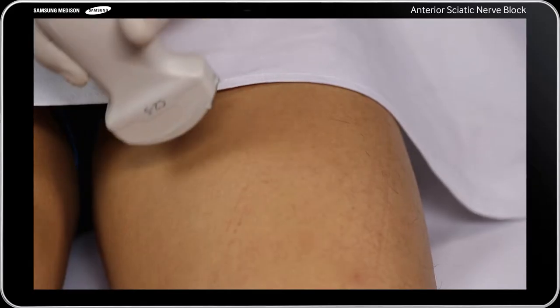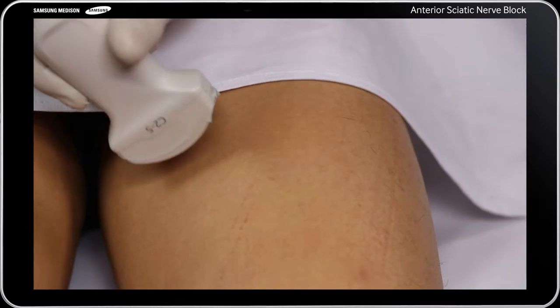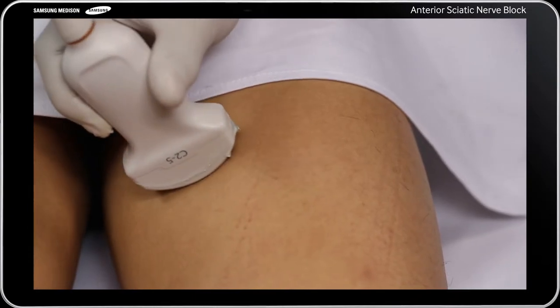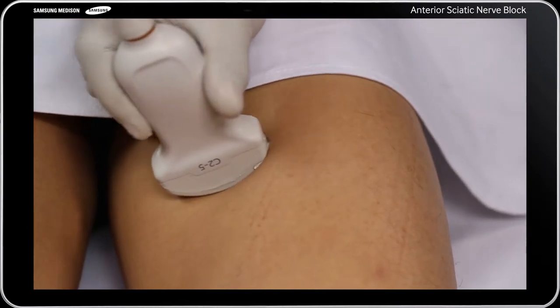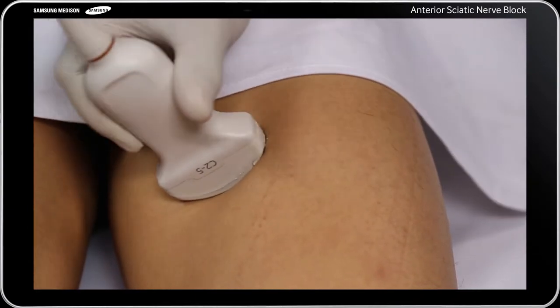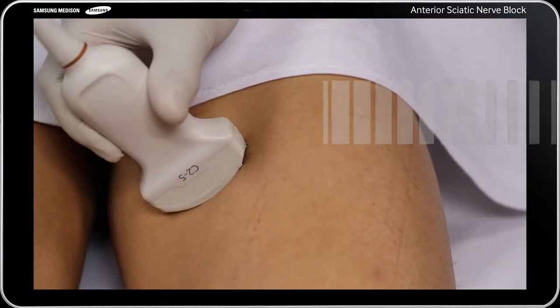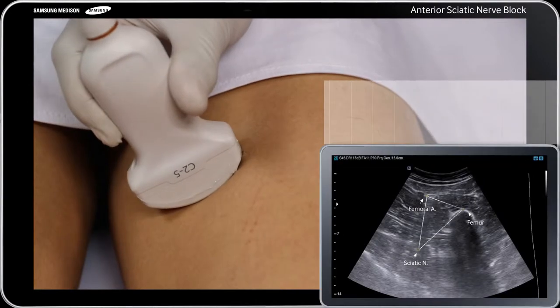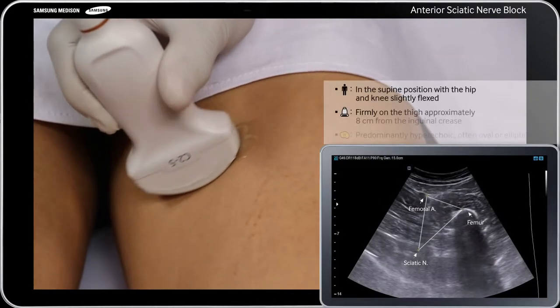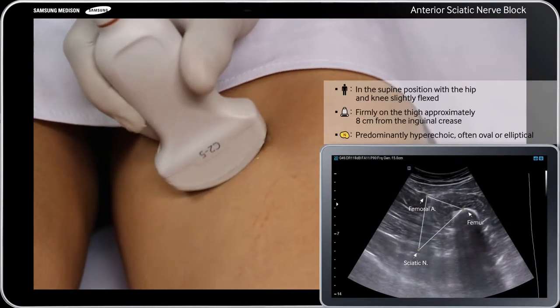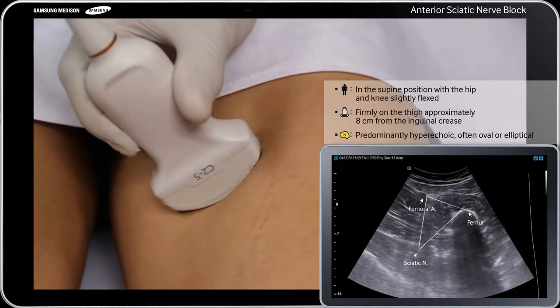Position the patient in the supine position with the hip and knee slightly flexed and the hip externally rotated approximately 45 degrees.